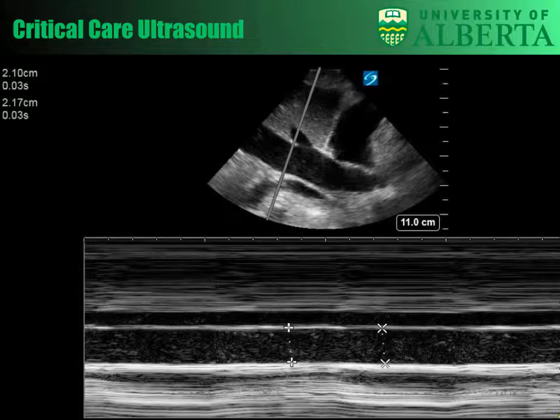That's using M mode, if the patient doesn't have much motion of the IVC. What M mode actually is, the y-axis is the graphical display. This was like the first generation ultrasound type thing, where on the y-axis we have the image, and on the x-axis we have time. So this is actually not space. This is one image which is repeated in time.